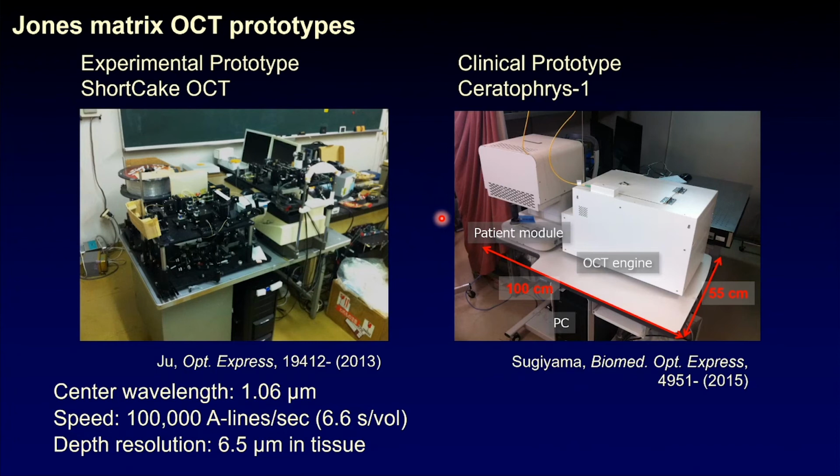And we took several clinical data. Even now, we have a next generation of this Ceratophrys 1 and also a next generation of this device, and they are working in a clinic at this moment. This Ceratophrys 1 itself has already been retired. We retrieved it back into our optics lab and now use it as a test implementation platform for new measurement functions. It's a second life for him already.